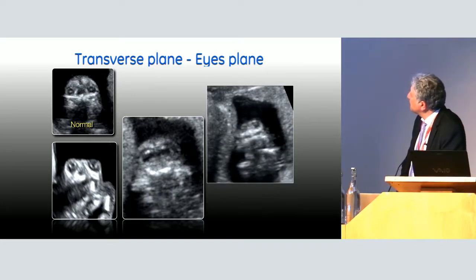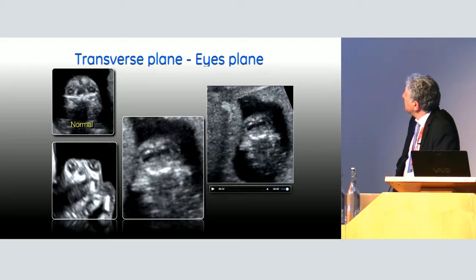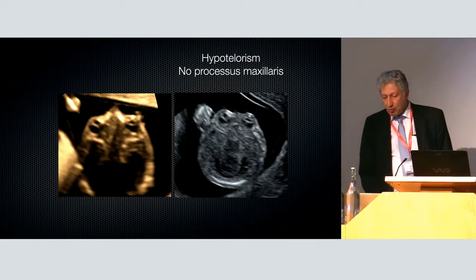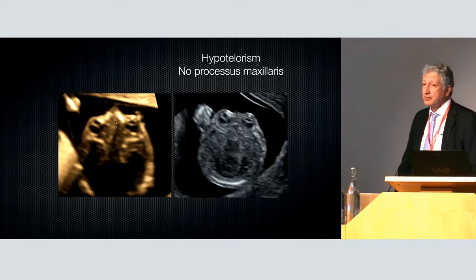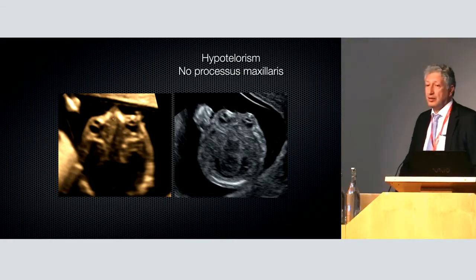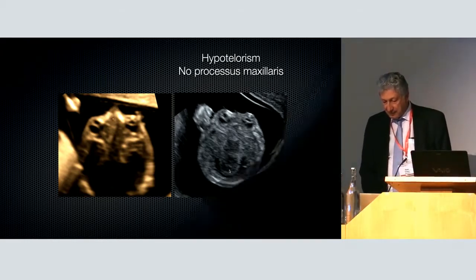This is a very good and nice view, a frontal view of the face, kind of coronal. These are the typical eyes in anencephaly, and these here are typical for holoprosencephaly with some hypotelorism. So one of the hints you can use at this stage is if you don't have a nose, because you have arhinia or other disease, you don't have these white dots at this level, and you have very narrow eyes. In hypotelorism, this was also in holoprosencephaly, as you can also recognize in this part.